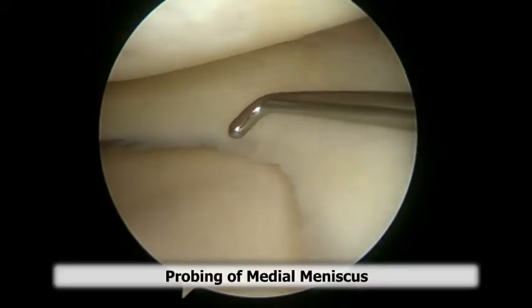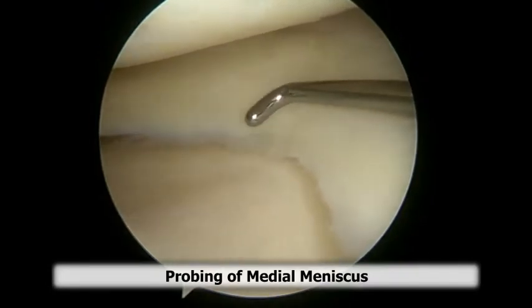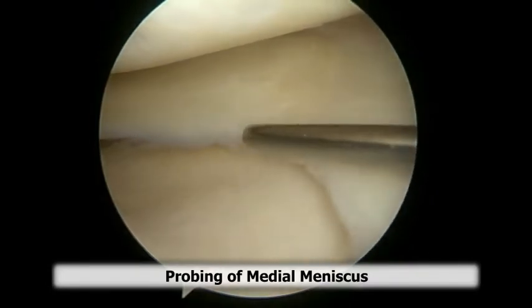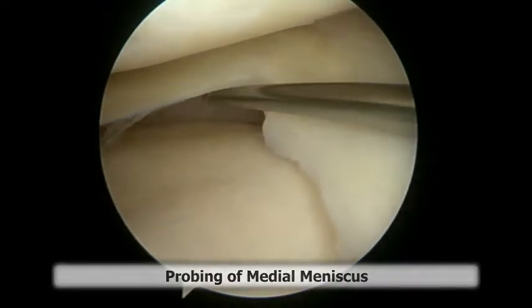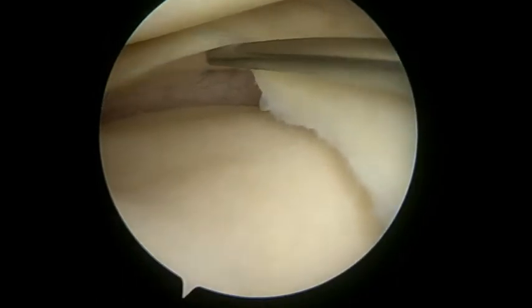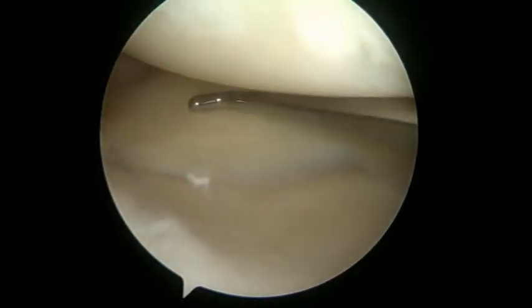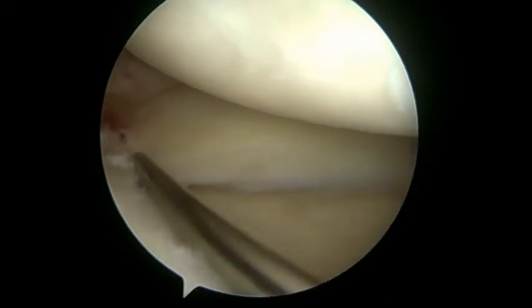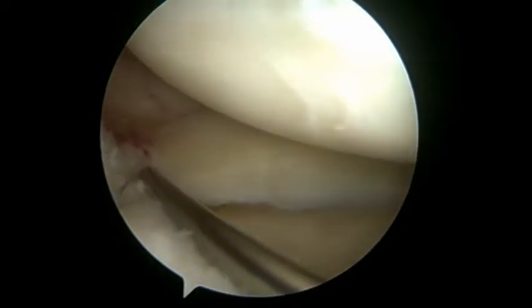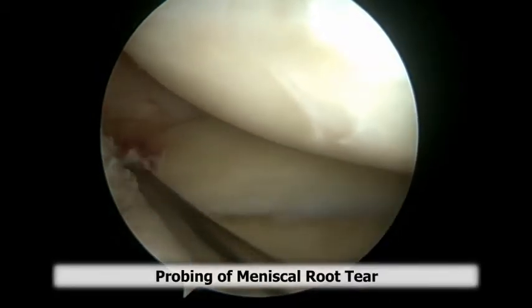We start by viewing through the standard lateral portal and probing the meniscus through the medial portal. You can see here the unstable meniscus root, and it is important to include this portion of the meniscus in your standard diagnostic examinations.